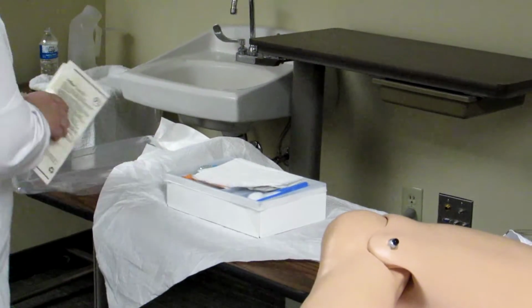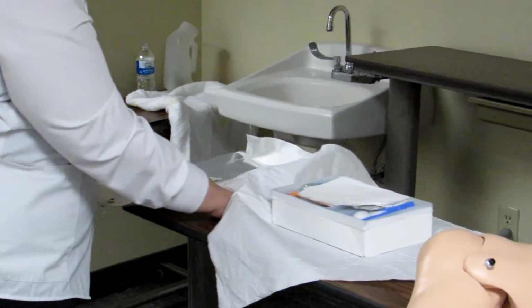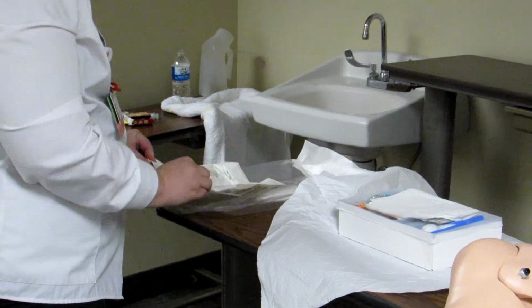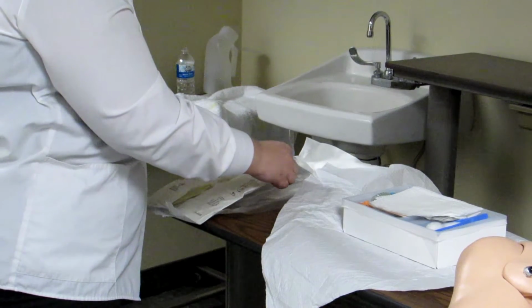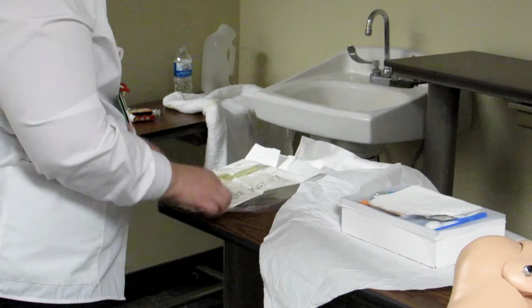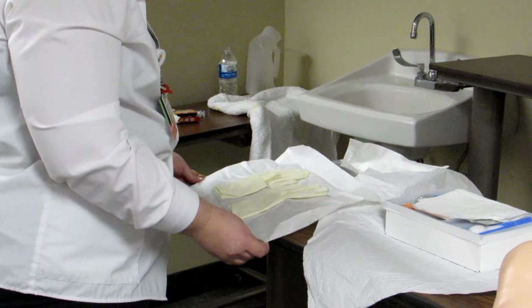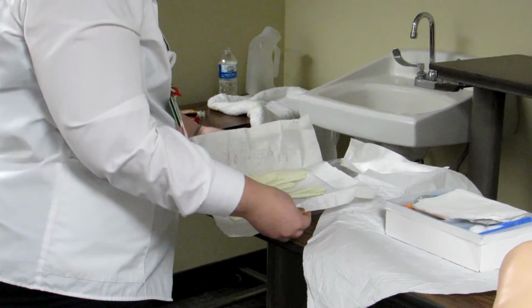Might need to refresh on how to do that. You want to make sure that you're not going to open your sterile gloves up onto your Foley catheter kit. Remember all of your rules of a sterile field. You don't reach over it. You don't turn your back on it. The outer 1 inch is not considered sterile.